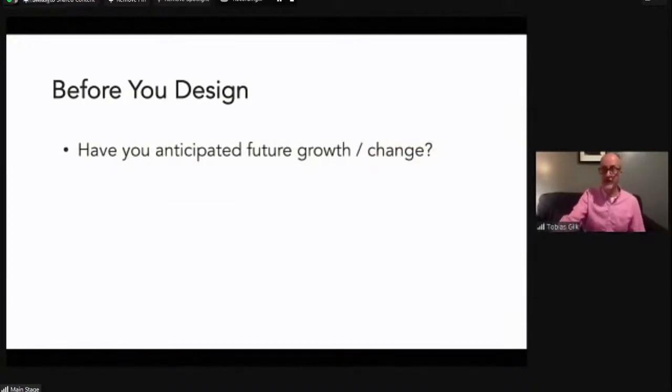And again, anticipate how today's use may change over time, because MRI facilities are both expensive and difficult to work in. And I guess a third thing, MRI is critical patient care today. It is a vital diagnostic tool in our ability to treat patients. So not only is it expensive and complicated to take an MRI down to make renovations to it, but there's a third cost just in terms of the interruption to patient care.